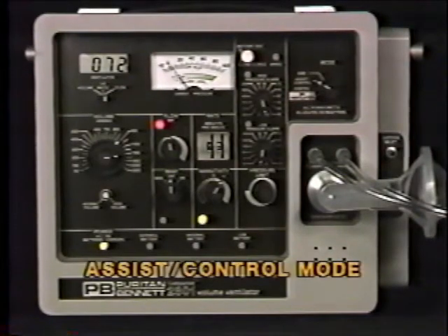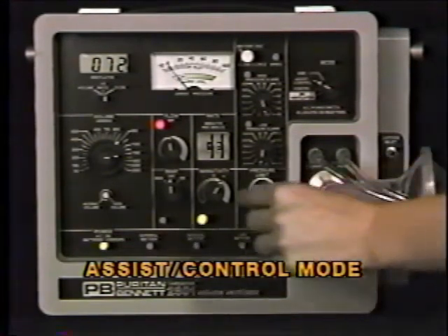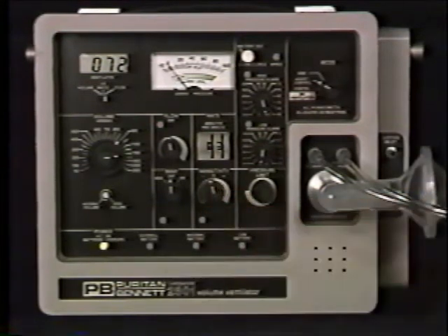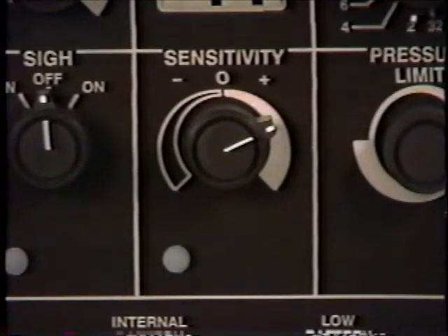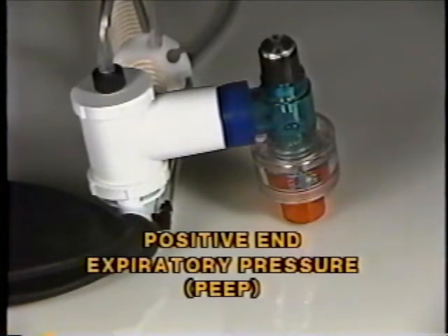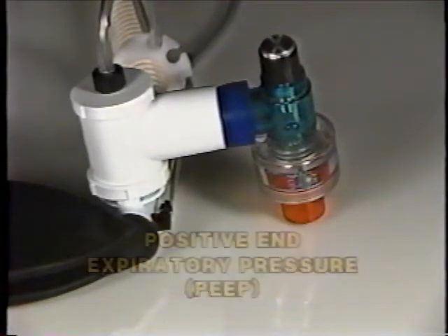In the assist control mode, if the sensitivity control is set to the right of 0, the ventilator will auto-cycle. Both the sensitivity and flow control indicators will light, and an audible chirp will be heard each breath. Turn the sensitivity control counterclockwise to the point where autocycling has discontinued. The only time it will be necessary to adjust the sensitivity control to the right of its zero position is to reduce the level of patient effort required when positive end expiratory pressure, PEEP, is prescribed.